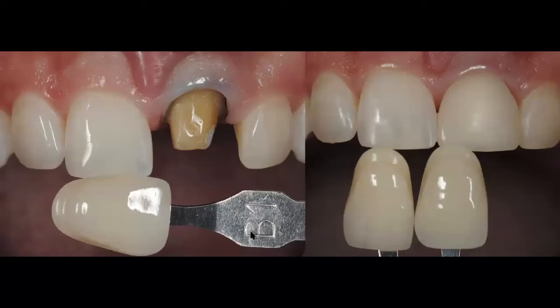Now, why is this photo so important? Because you can see that this lateral is a little bit darker than the central. And this is the natural teeth of the patient. Patient did not want to do any bleaching. So we have to work around what the patient has and what the patient is expecting to achieve, or what the goals and expectations are based on what we have shown them, in previous cases, in other photos.